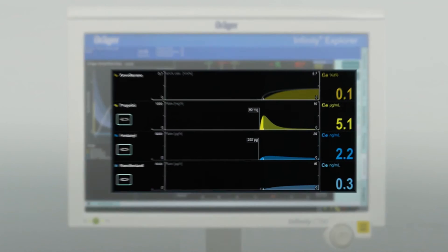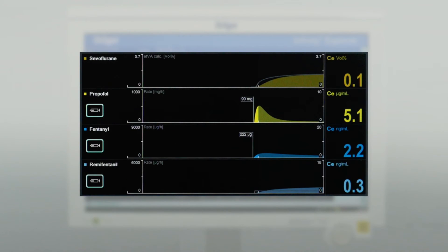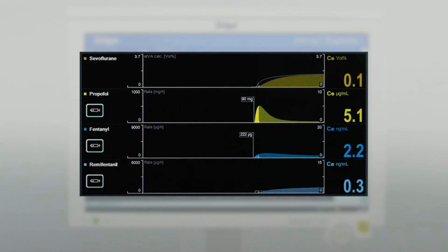On top of the timescale, you see the pharmacokinetic graphs on which anesthesia drug concentrations at the effect site — such as hypnotics for sedation and opioids for analgesia — are displayed as a numeric value as well as a colored trend graph. In this section, up to four drugs can be displayed.